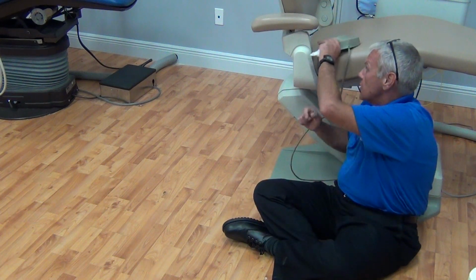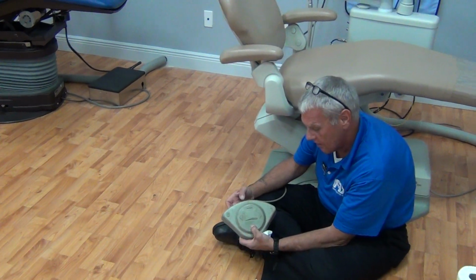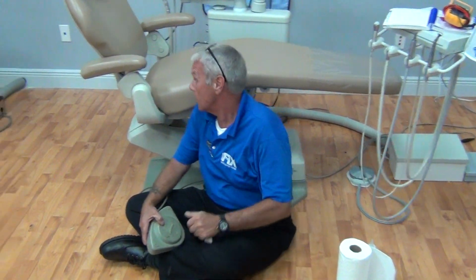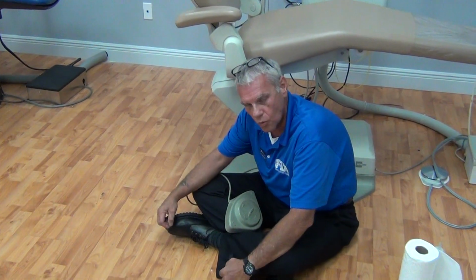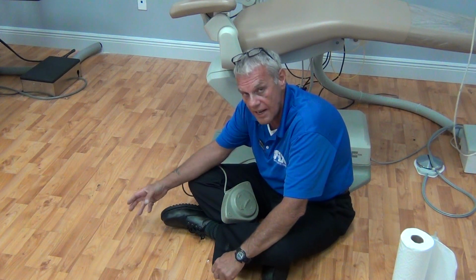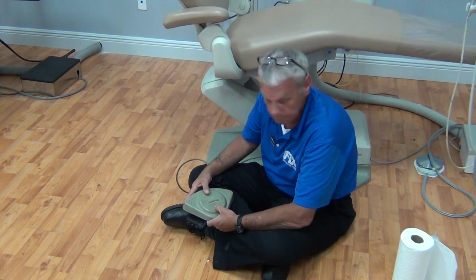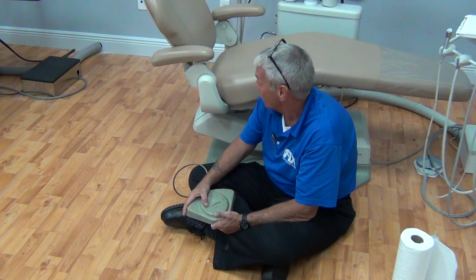Okay? Let's check our foot control function while we're down. First, we're going to check down. We're depressing the foot control with our hands, being careful to watch our environment, that we're not going to tear something up. Keep your eyes open. We're going to raise. We're listening for whines, hums, a high-pitched whine or a geek, geek, geek, geek, which would signify that the chair is low on oil or is hydraulically aspirating air into the system in lieu of hydraulic fluid. And it sounds good. We're going to lower back down. Again, being aware of our environment. Good lower. Now, we're going to let the back down.